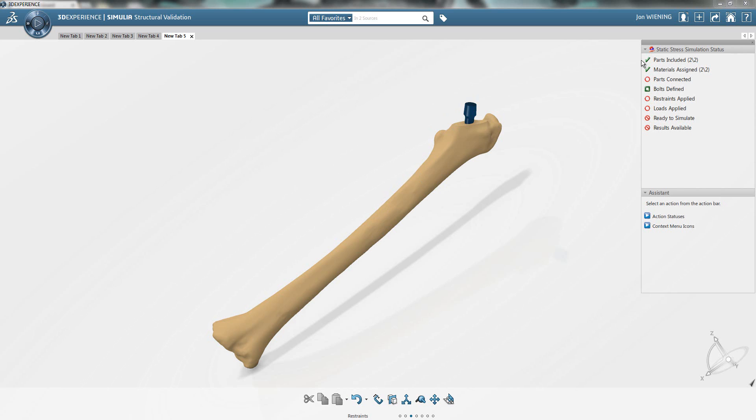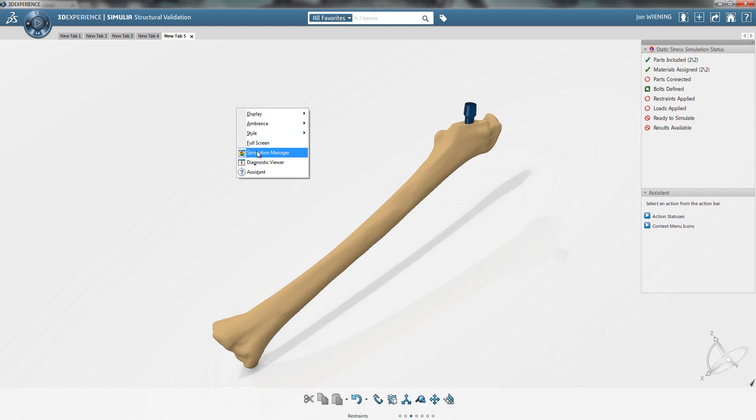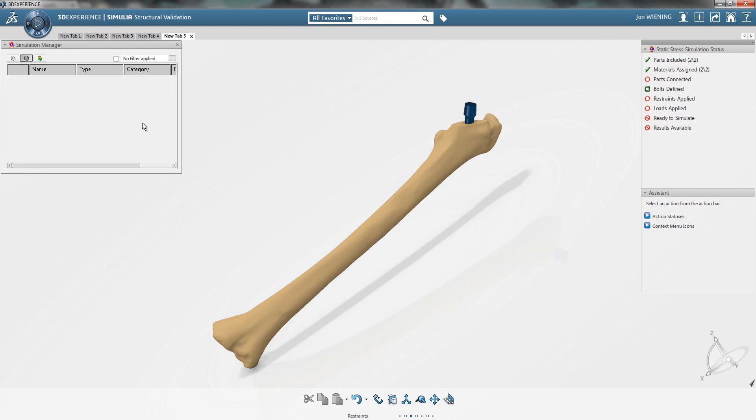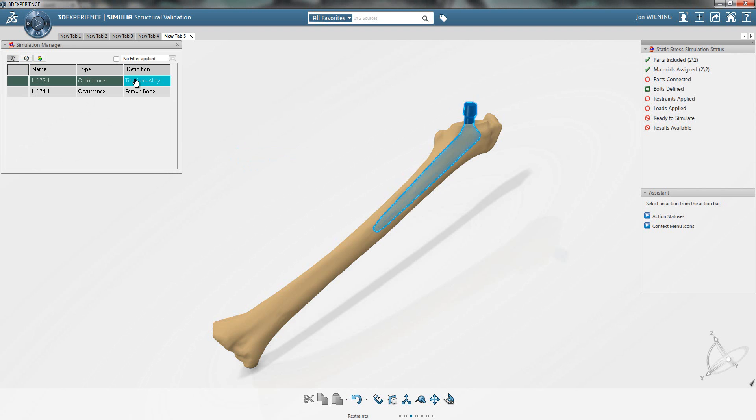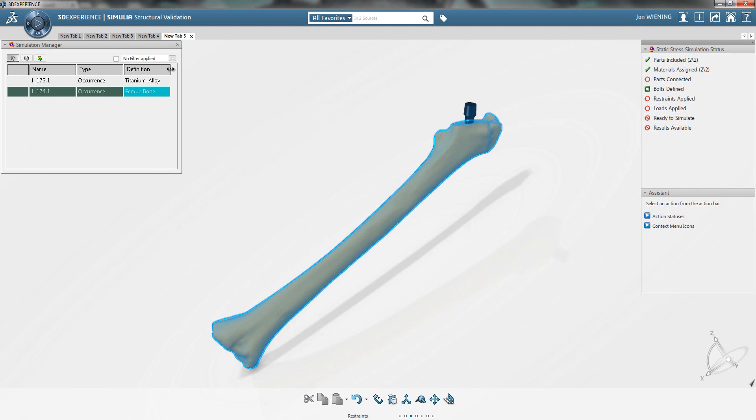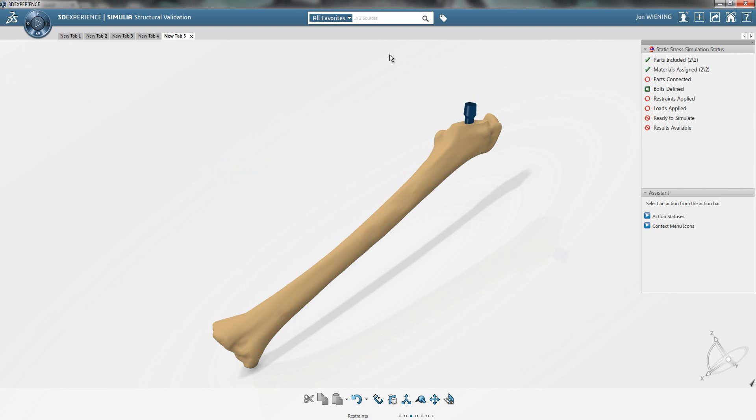We have two parts: the bone and the implant. Materials have already been assigned to each of these components. You can see that the implant has a titanium alloy material and the bone has a bone material.